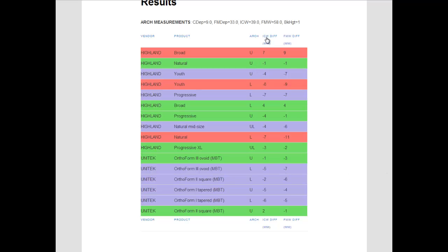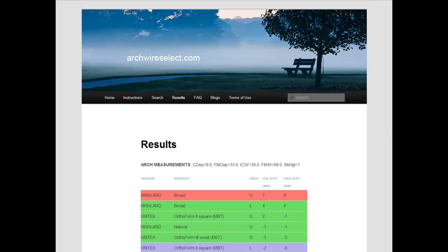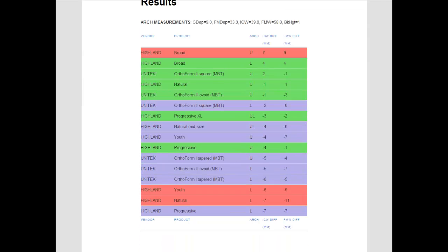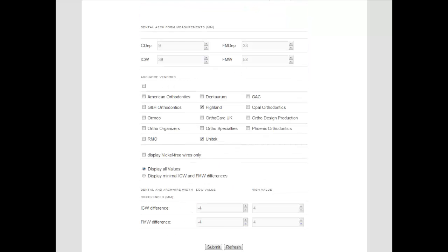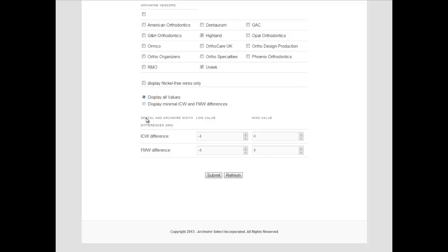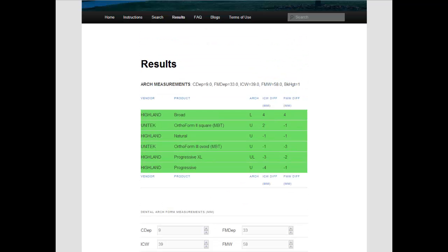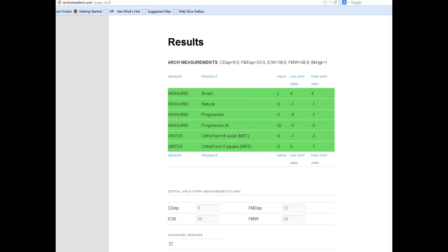Let us begin our selection by sorting the arch wires by intercanine width. Assuming our treatment goal is to maintain the presenting canine and first molar positions, let us now restrict the width differences to be at most plus or minus 4 millimeters. We do this by filling out the dental and arch wire width differences section of the search and results form. We now hit the Submit key and refresh the screen.